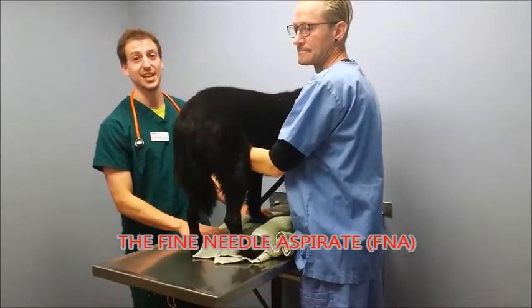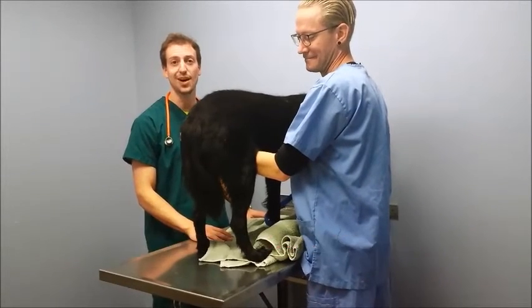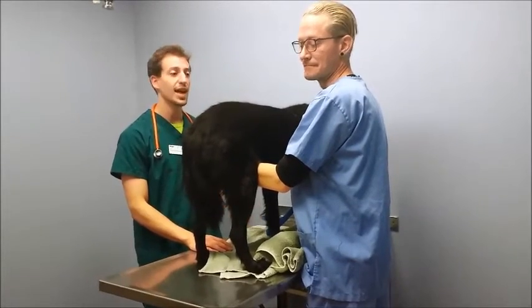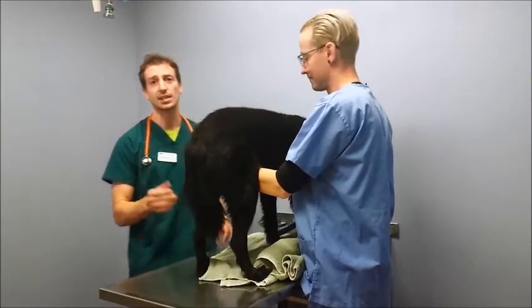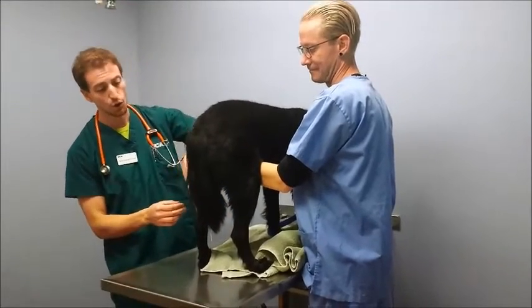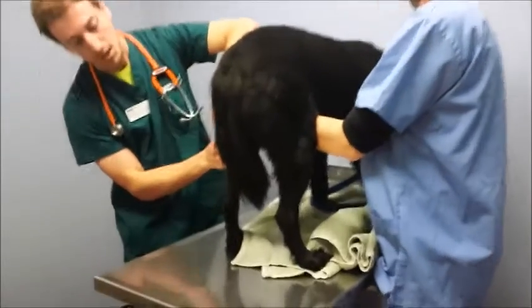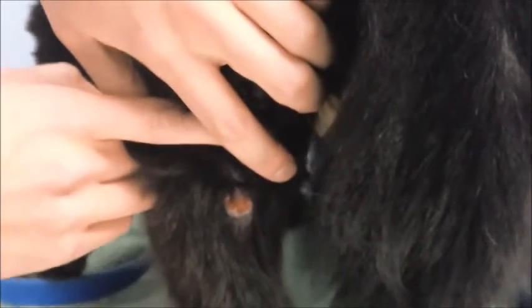Thank you for joining us at VCA Salem Animal Hospital for our next installment of 'My Vet Wants to Do What?' You all know Andrew. I'm Dr. Rob Siefkin, and today we have about a six-year-old flat-coated retriever with a small mass. I'm going to have Heather, our camera lady, come on over and show you the mass. What we're going to be doing today is called a fine needle aspirate.